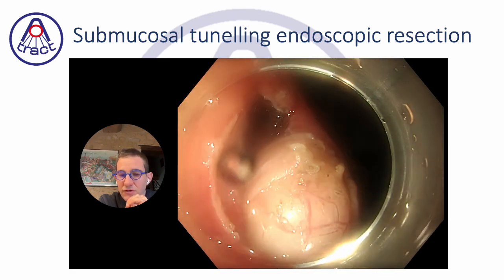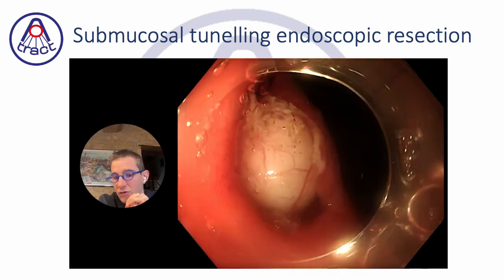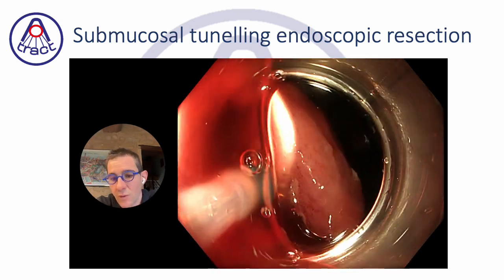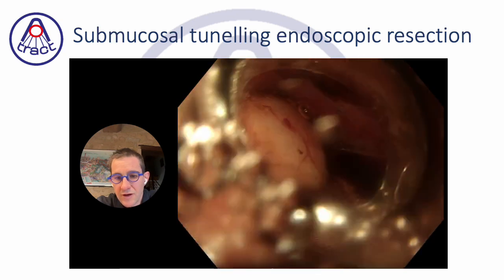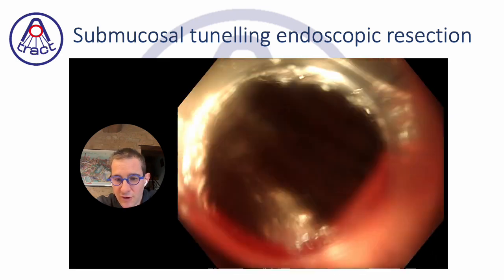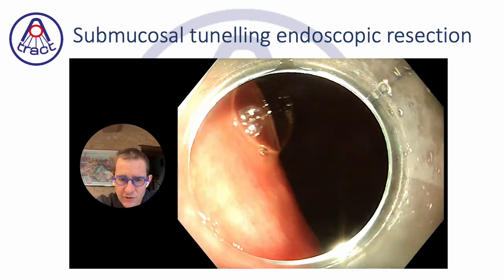We see that it is entering into the cap here on a gastroscope. So the size of the cap is 10.5 millimeters. So the lesion is probably around 1 centimeter. You will see it. I'm sorry for this long exposure and long extraction of the lesion, but finally I think we will manage here, or almost.